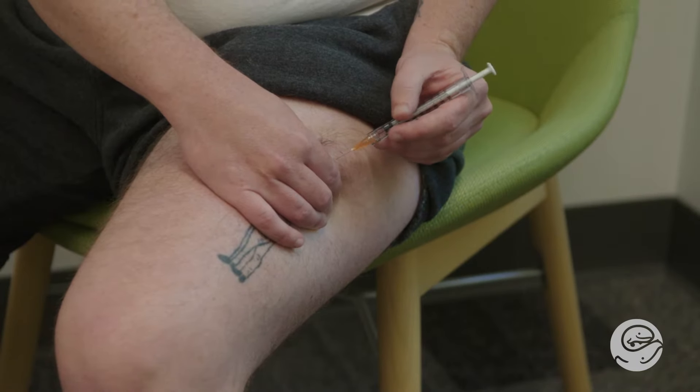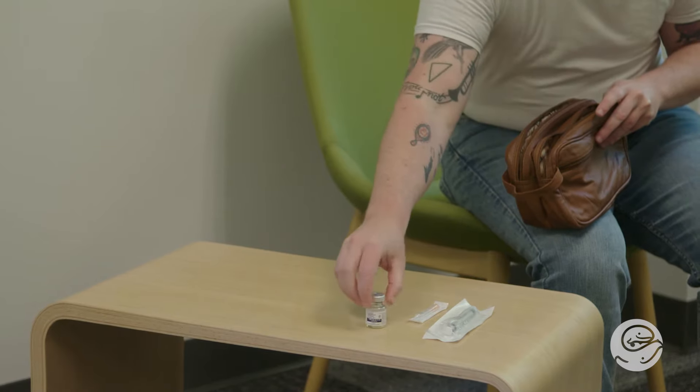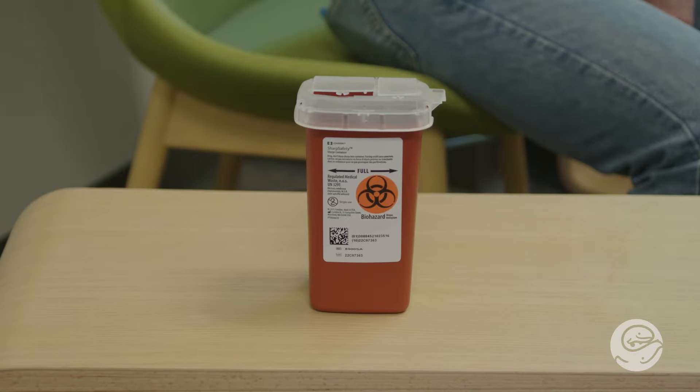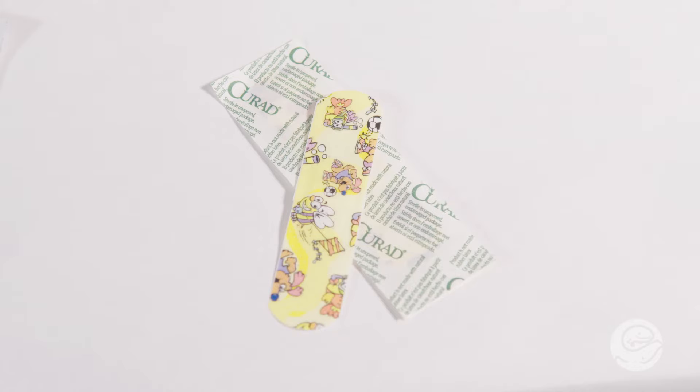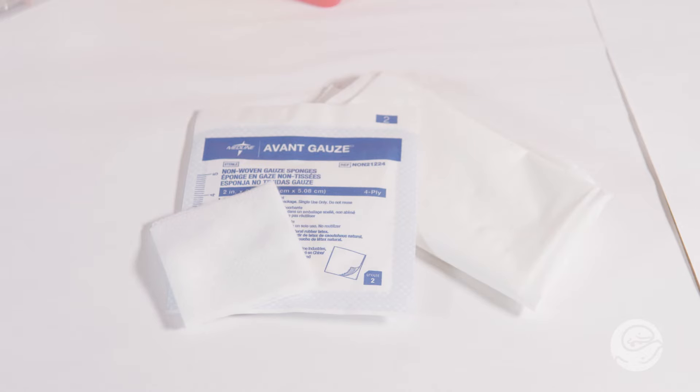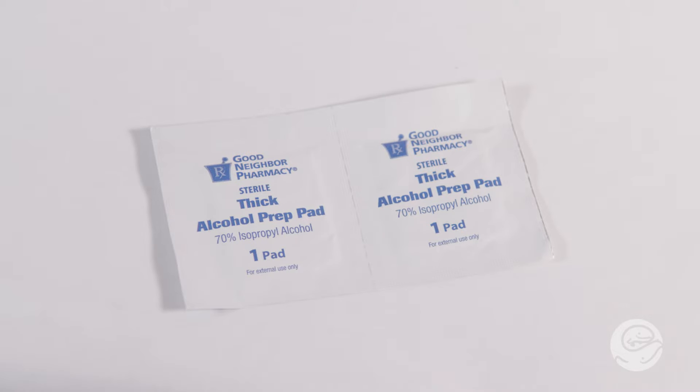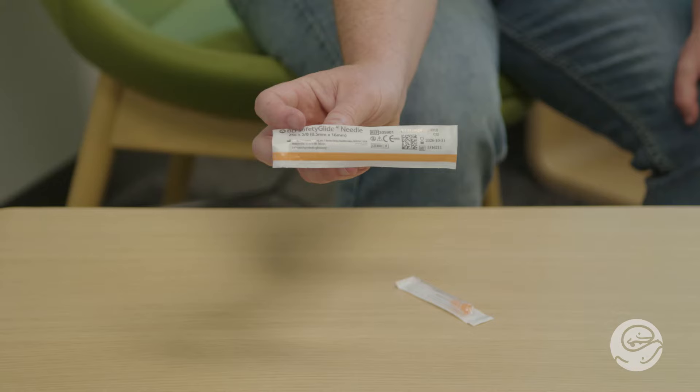Gather your supplies. Begin by gathering your supplies. This may include a sharps bin or puncture-proof container, a band-aid, gauze or cotton ball, two or more alcohol wipes, one for the top of the vial and one for your injection site, a 25 gauge needle that is 5 eighths of an inch long. The gauge is how thick the needle is. Your provider may discuss other needle options depending on your needs.